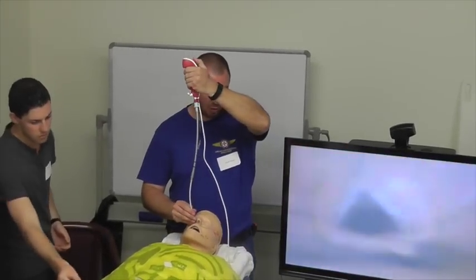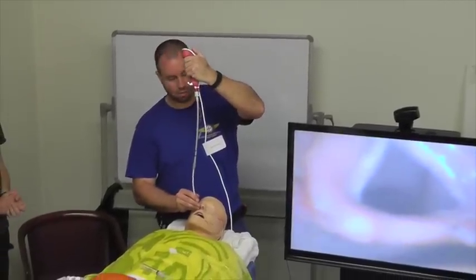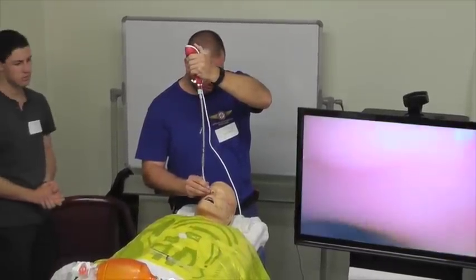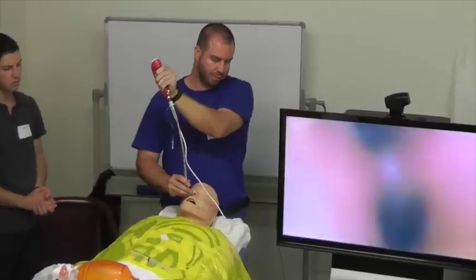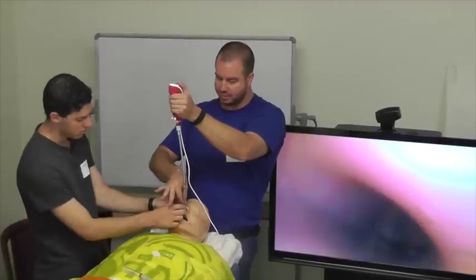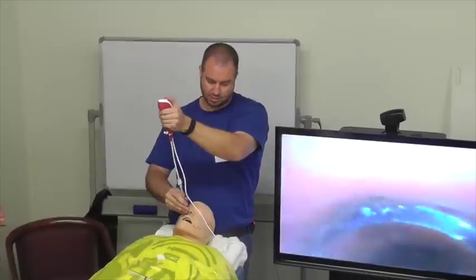They may cough at the point where you spray some stuff on their vocal cords. Let it give time to work. Then we're going to advance it through the vocal cords, all the way down into the trachea, seeing tracheal rings, keeping the center of the picture of the view that you want to have. I'm going to get my airway assistant at that point to take out the split nasopharyngeal airway, and then I'm going to advance the tube over the top, keeping the view on the screen the whole time.